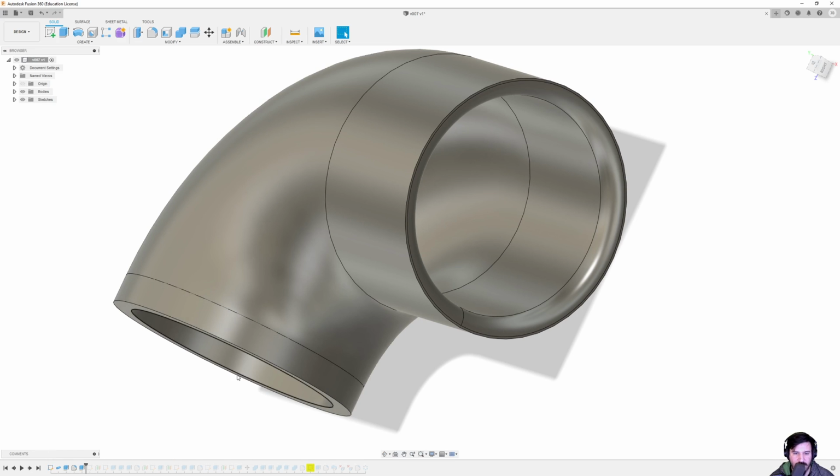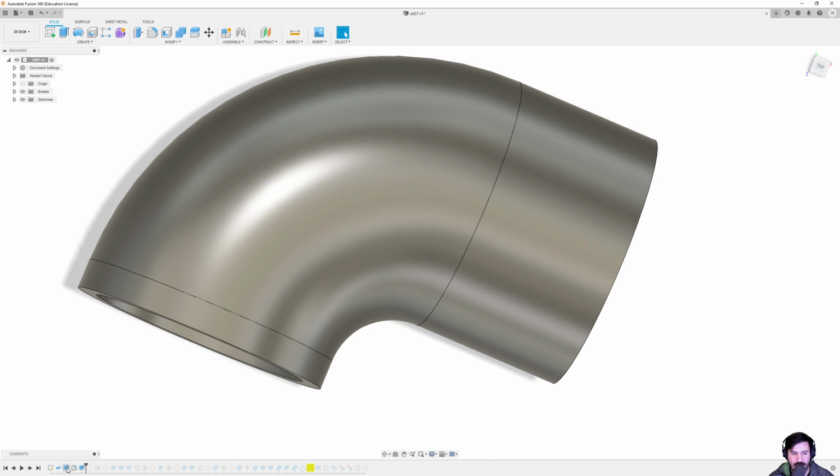Next, I shortened this end. Initially, I had it much longer. You can see in this one, or maybe some of the videos I had, this length here was quite a bit longer. But we determined that it did not need to be that long. Oh, it would print faster. We'd be able to print a lot faster if it was shorter. So we trimmed this off, and this was trimmed as well. That probably was what one of these extrudes was. It was a negative extrude. Oh, right. So initially this was the length, and I had a positive extrusion here.